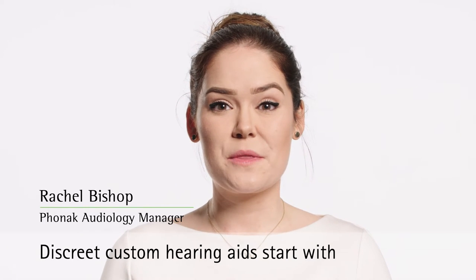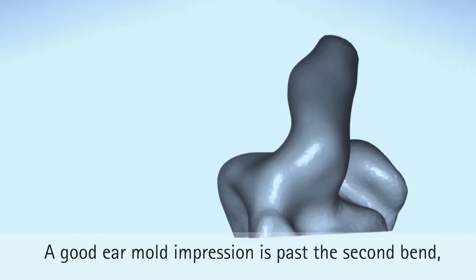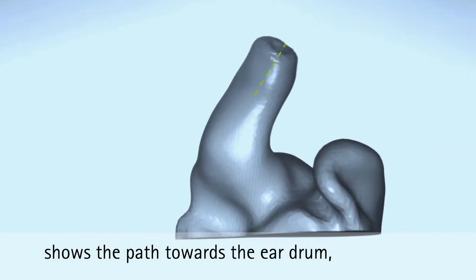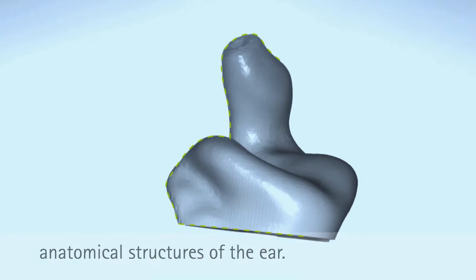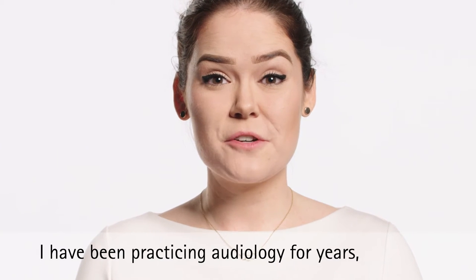Discrete custom hearing aids start with quality deep ear impressions. A good ear mold impression is past the second bend, shows the path towards the eardrum, is free of any voids, and includes all anatomical structures of the ear.